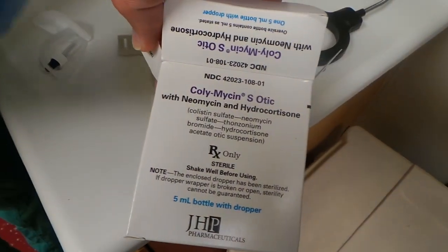We're gonna go ahead and put some antibiotic drops in the ear, but we're gonna put an ear wick in first. We'll do that right here. You ready for it? All right, cool. We've got the antibiotic drops here.